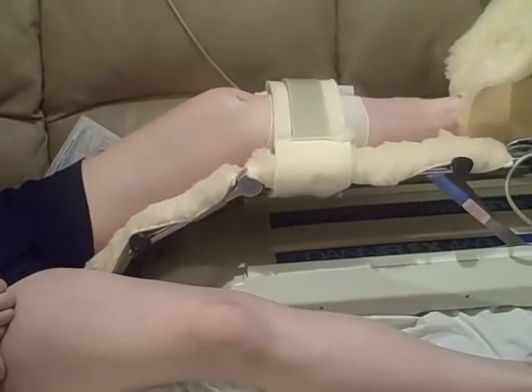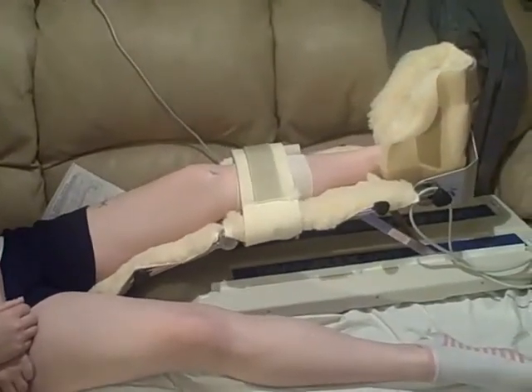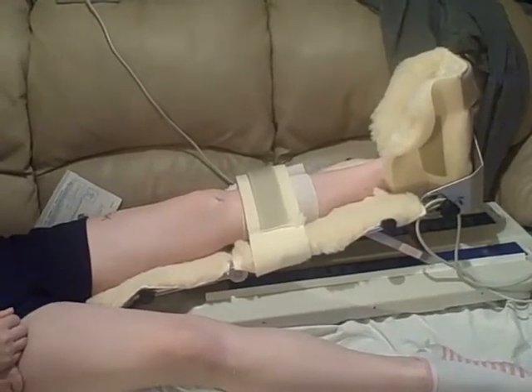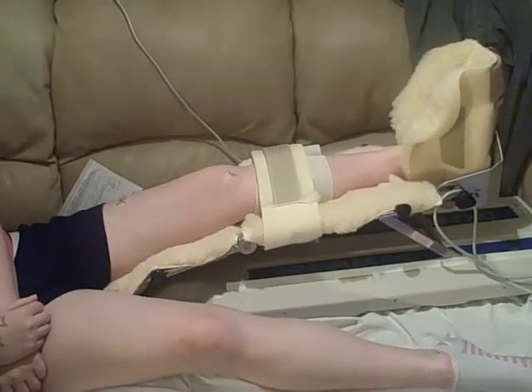The patient sits in this for an hour and it just moves the knee back and forth slowly from extension. There's full extension, and then it starts over again into flexion.